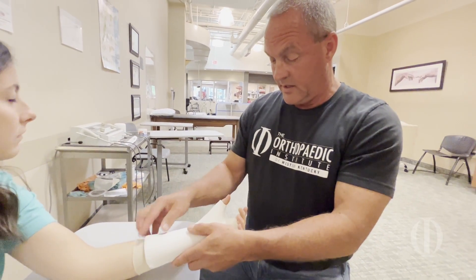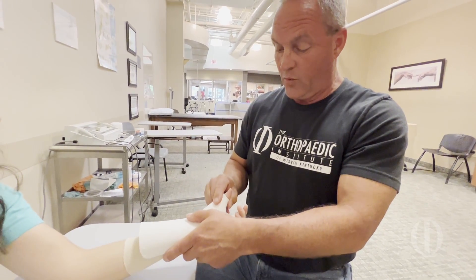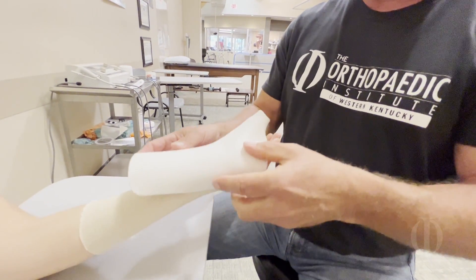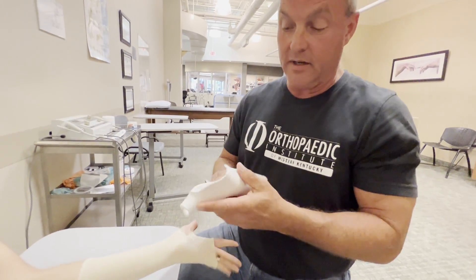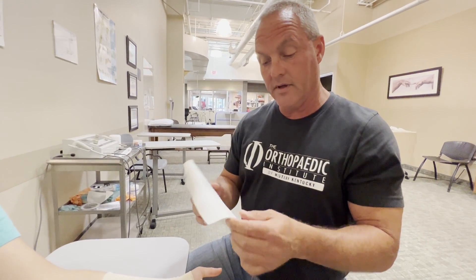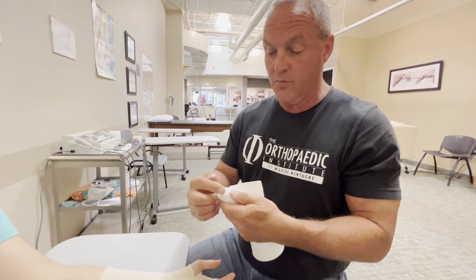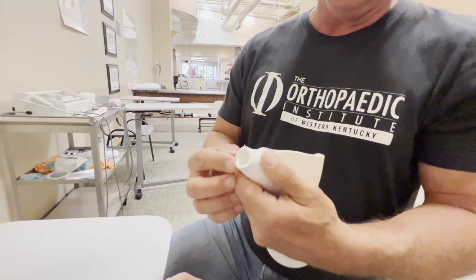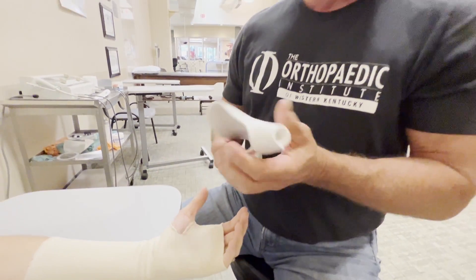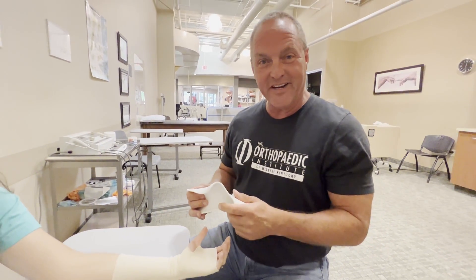After about two or three minutes the splint is pretty well formed. We'll slide it off. From this point we can smooth edges, round back the part against the forearm, and make sure that the thumb area is sufficient to allow IP flexion. Then we're going to put Velcro straps on and you're ready to go.